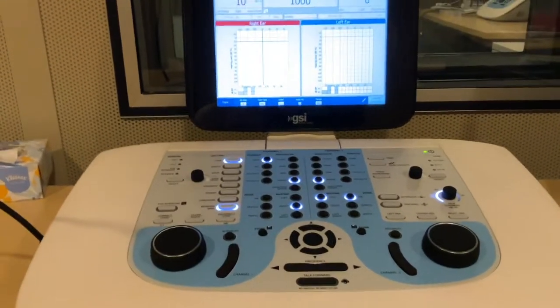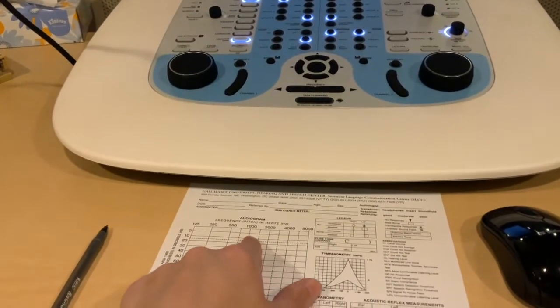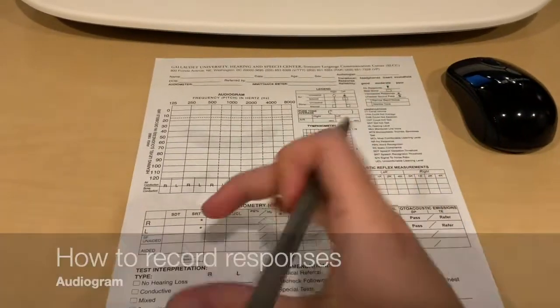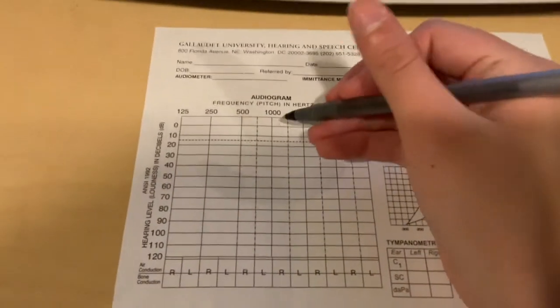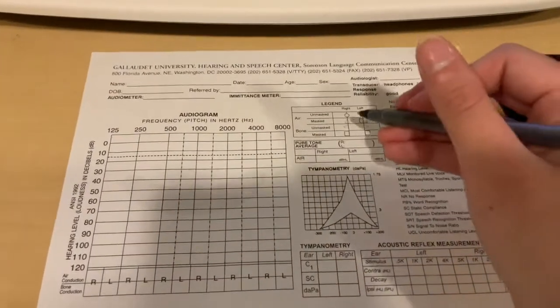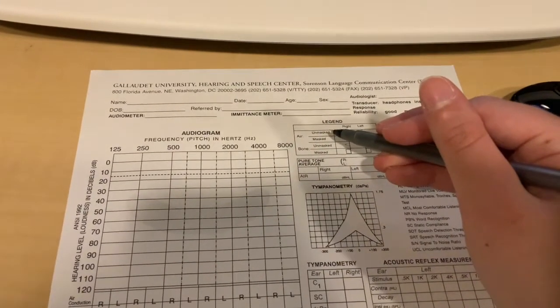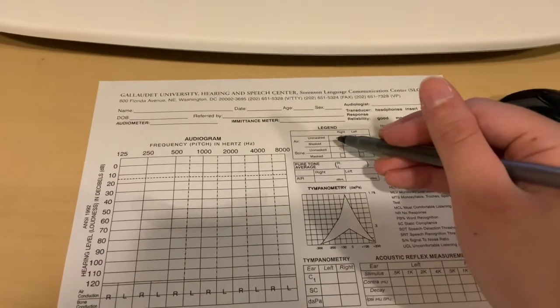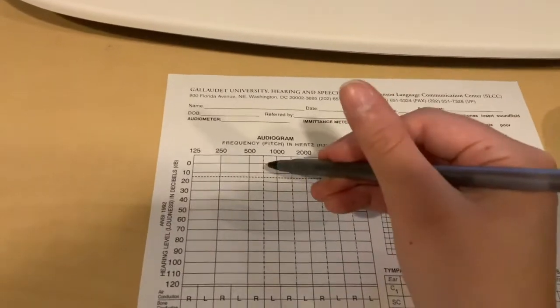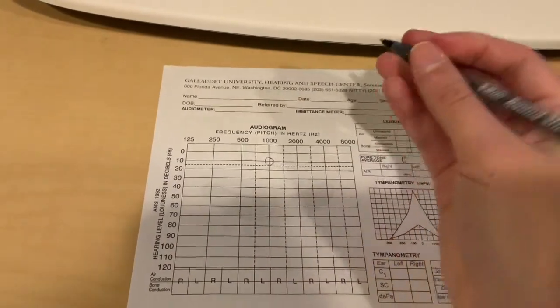So we'll record that on our audiogram, which we have here, and we'll write it down at 1,000 hertz at 10 dB. So I'll show you how we do that. Okay, here is the audiogram paper. And so we're going to write down Emily's threshold that we have at 1,000 hertz, 10 dB in the right ear. So the symbols we use for this are over here. In the right ear, we're going to use for air conduction, unmasked, which means we're not putting noise into the other ear. For that, we're going to use a circle. And so at 1,000, 10, we're going to write a circle, because that is the threshold we obtained.